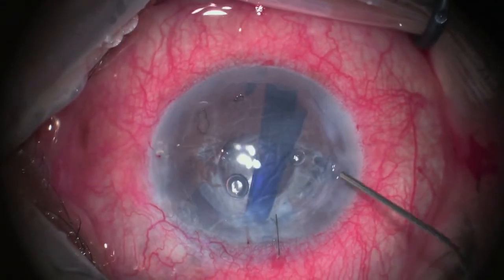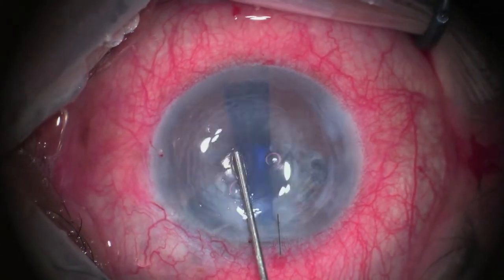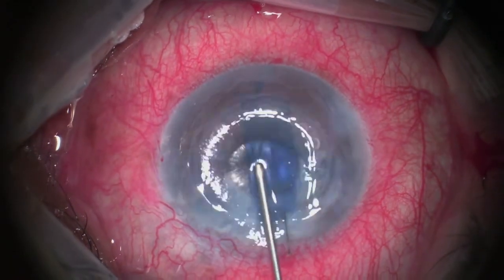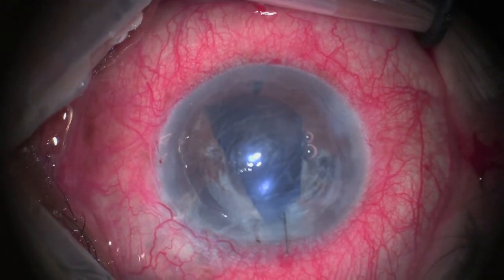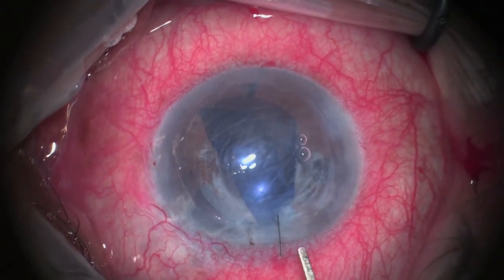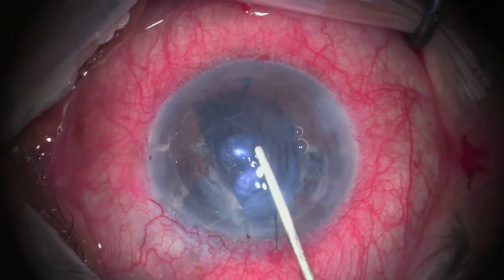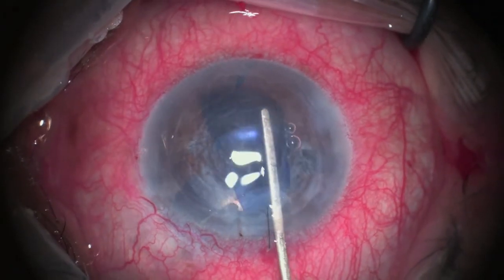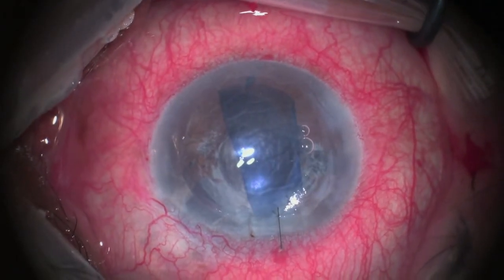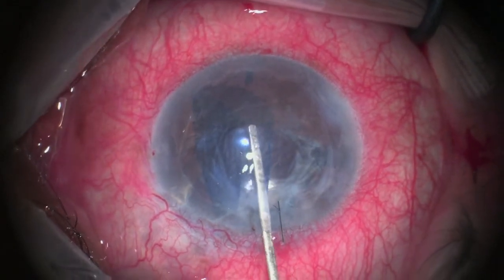Since this is a case of a crowded anterior chamber, I decided to take a suture to prevent extrusion of the graft. Tapping over the corneal surface is done to unfold the graft. Then confirmation of the proper orientation was done by introducing a spatula in the anterior chamber and noting the change of color of the spatula as it is covered by the folded edges of the graft.